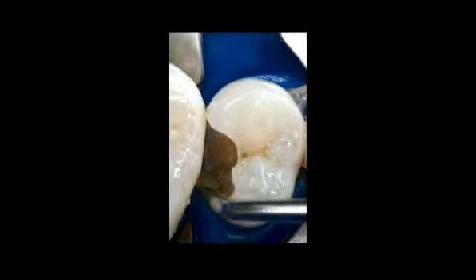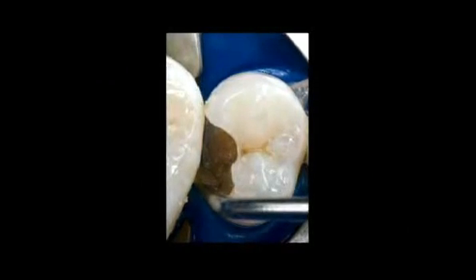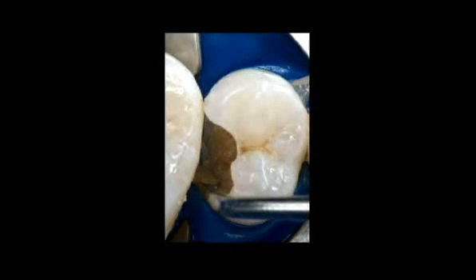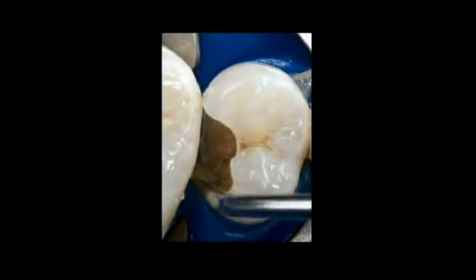The inner carious dentin layer, the affected dentin, consists of a zone of demineralized dentin and is relatively bacterial-free. A spoon excavator was used to remove the remaining infected carious dentin, limiting the size of the preparation while retaining areas of demineralized dentin and enamel that can be allowed to heal through remineralization.